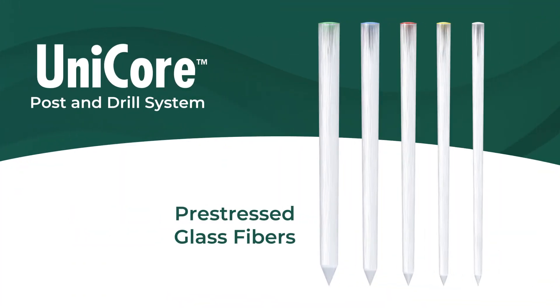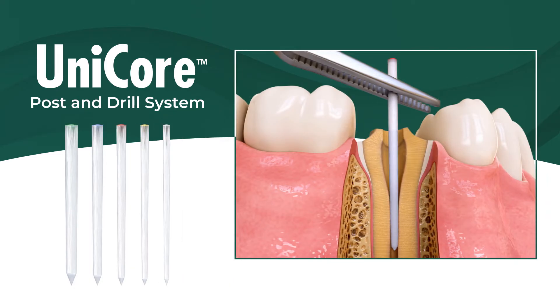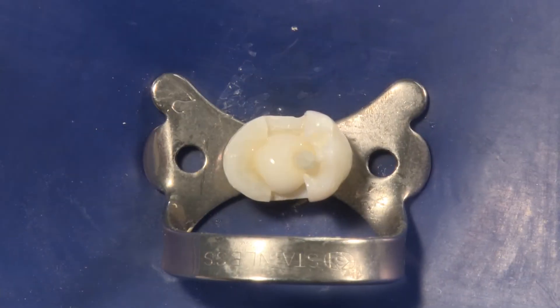The unidirectional Unicore glass fiber posts have a flexural strength similar to dentin, and each has a gentle taper to correspond to the natural anatomy of the tooth. If needed, Unicore accessory posts can be used to better accommodate oval or flared canals.